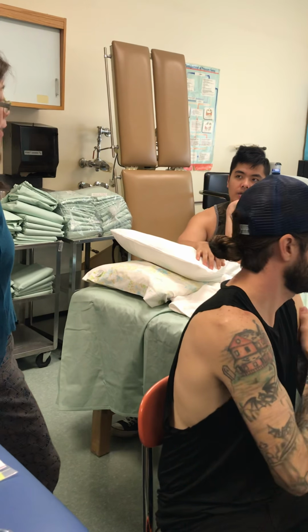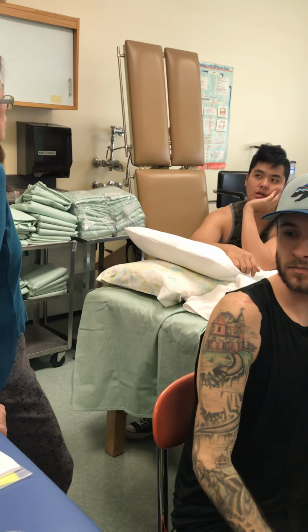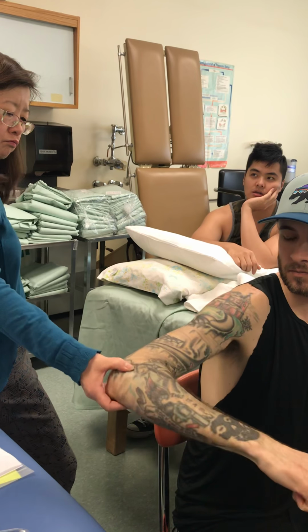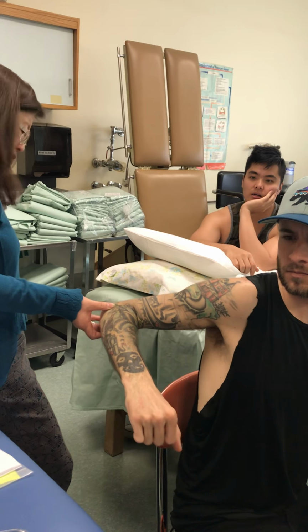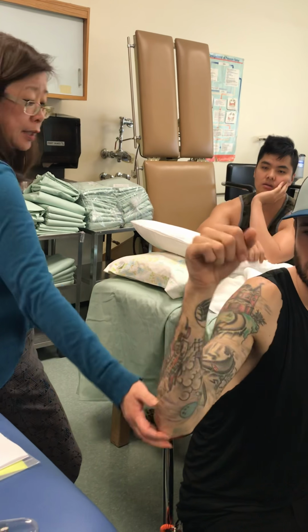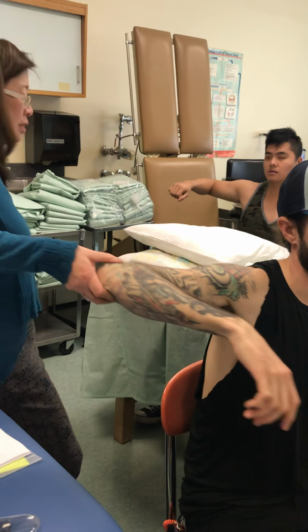When you did the horizontal abduction, how come you didn't look out for his elbow dropping? Because when your elbow drops, you can get more range of motion. Not really. I mean, it's fine. It's still up there. You still get the same amount. I'm making sure it doesn't drop down here. As long as it's up here, it's like this.